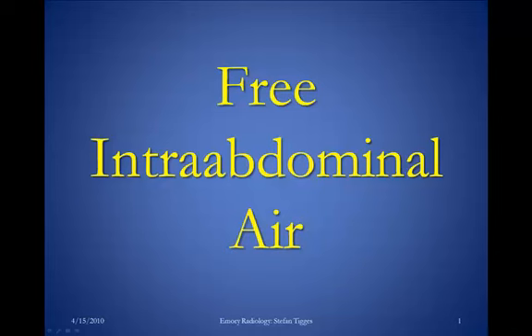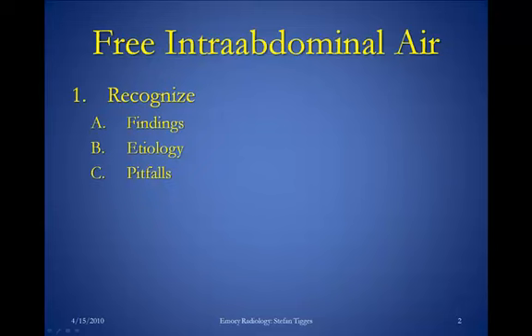Welcome to this presentation on free intra-abdominal air. This is really sort of a crude first attempt. Hopefully we'll be uploading a better attempt in the future at looking at this problem. But for now I just want to have something up there for you to look at so that you can recognize the findings, the etiology, and a couple of pitfalls of free intra-abdominal air. But again, hopefully we'll have a more extensive presentation available later.